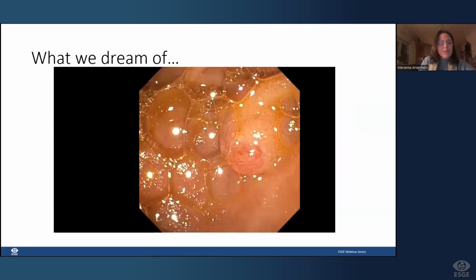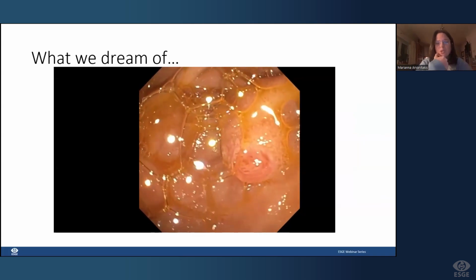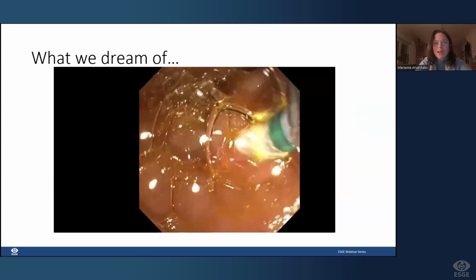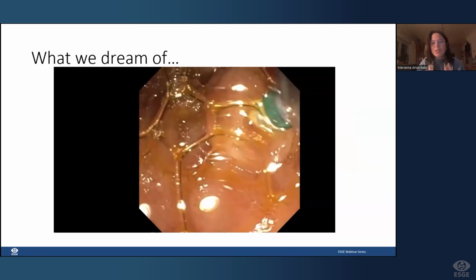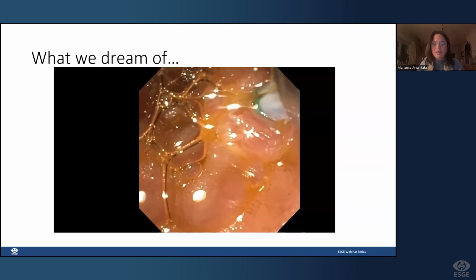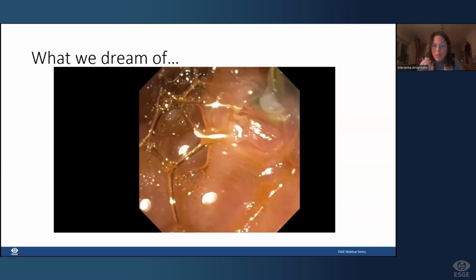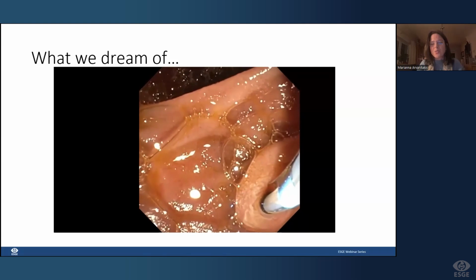And of course, sometimes this is what we get, which is what we dream of every time we start in ERCP, a nice bulging papilla, not too bulgy, not too small, like the perfect size. We use here a sphincterotome. We will have what we call an insinuation, that we will get into something. We feel that we're in something. This is this little common channel. And we will use the guide wire very slightly to go inside, maybe give it a little bit of a bend to be in the good direction. But when we have this feeling that we're in something, then if we are in the good direction, we have some chance to get into the biliary duct, as we were here with the guide wire.